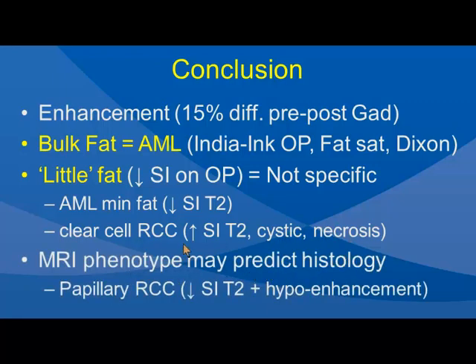And finally, there are some phenotypes on MR that are predictive of histology, like the papillary renal cell carcinoma with low signal on T2 and hypoenhancing.